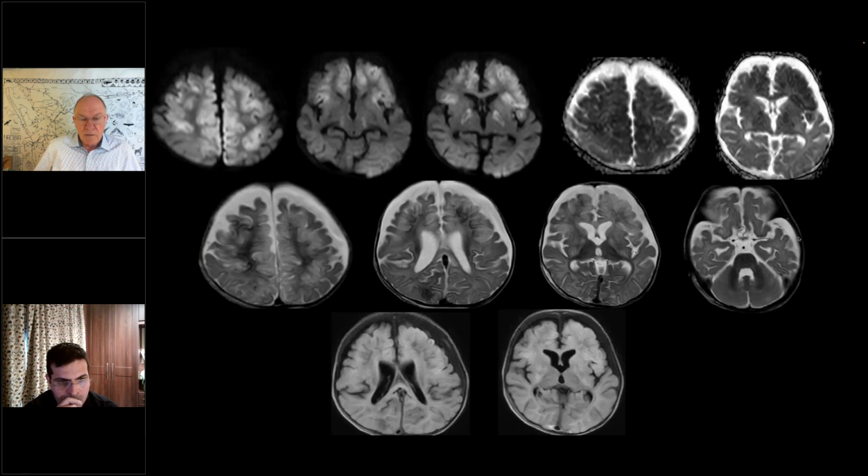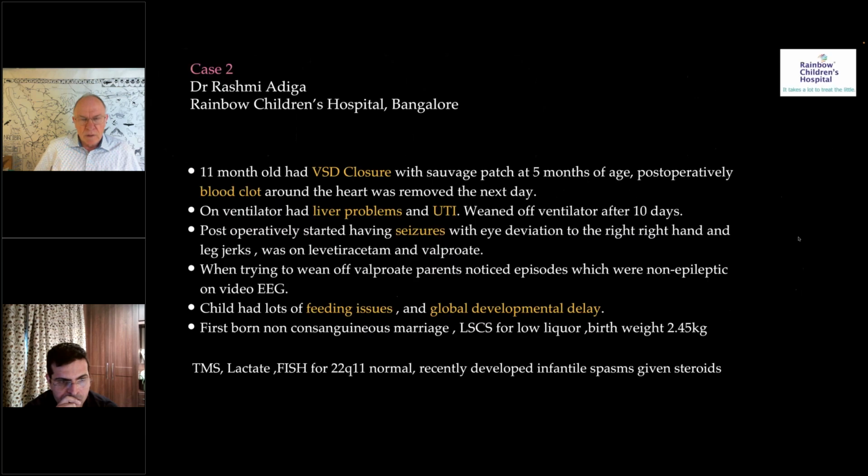We'll go on with the MR images. Yeah, again, sorry. In terms of history, I'm impressed that the problems start on day 1 or 0 after this more or less major cardiac intervention. That's remarkable. That's right, yeah. Because before the intervention, she was quite malnourished because she had a big VSD.